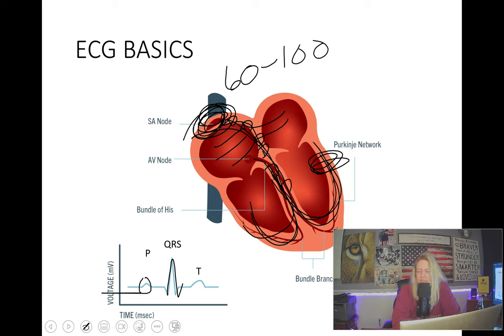Okay, so again, we're in lead two, which is what I like. I like to see lead two rhythms. My guess is on the NCLEX, they're pretty much going to be lead two rhythms. I don't think they're going to give you anything else. So let's look and see what we've got.